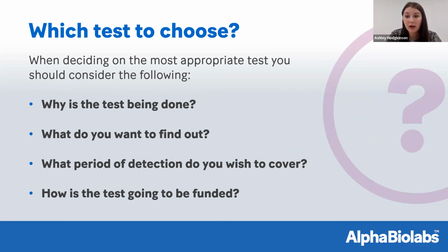So which test do I choose? I have a client who I know needs to do some form of drug testing, be that through head hair, body hair, or nails. What do I need to consider? And these are the most important things. So what you want to find out, why are we doing this test? What do we want to know?